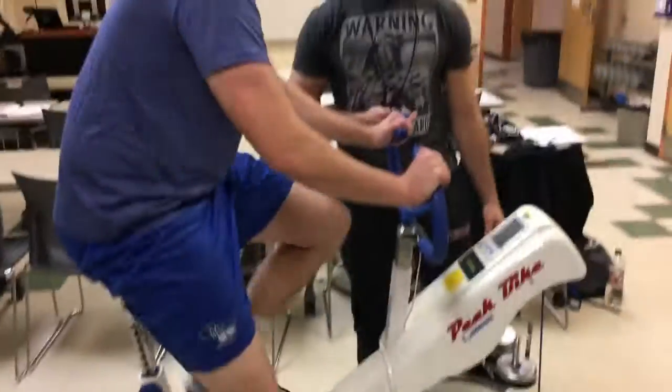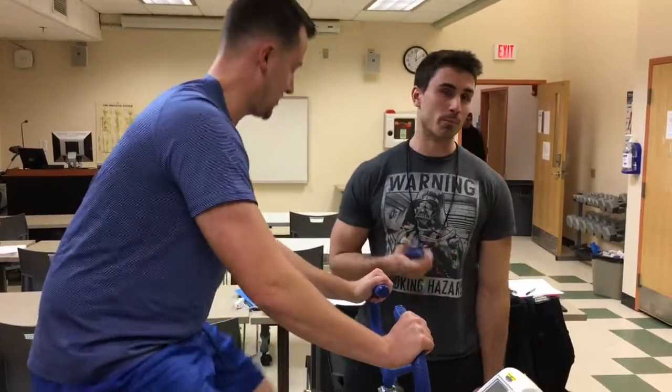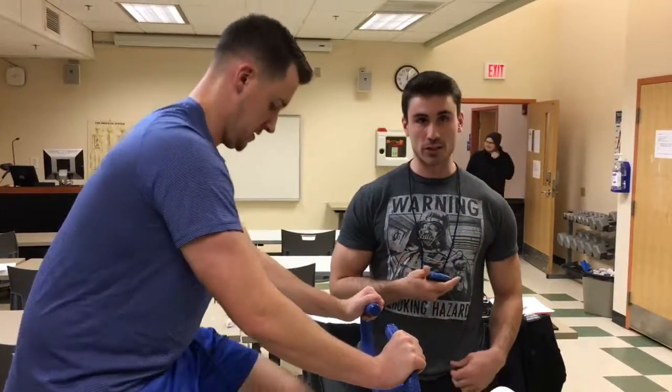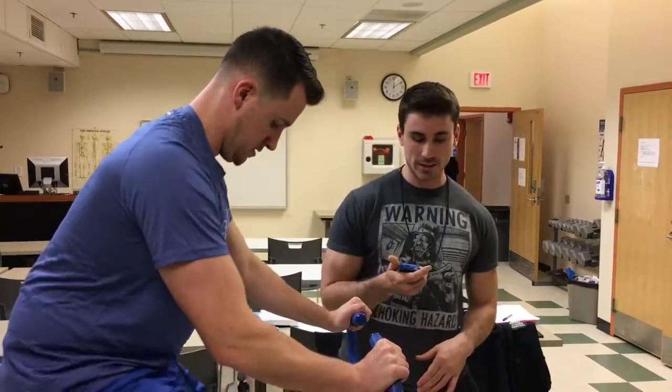We'll make this one your last one, okay? The cadence that he should be going at is about 60 to 70 rotations per minute. You're doing a good job. By the end of this warmup he should basically be getting to feel what the actual work weight is going to be when he does the test.